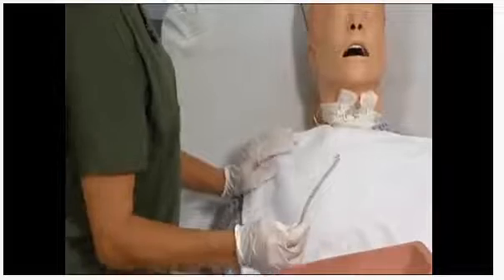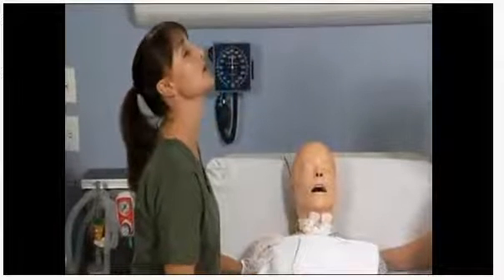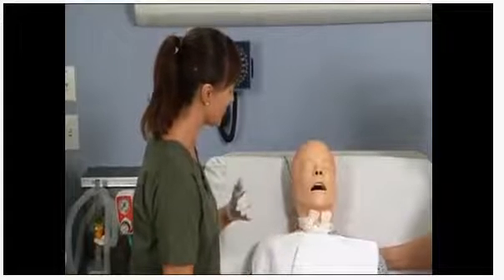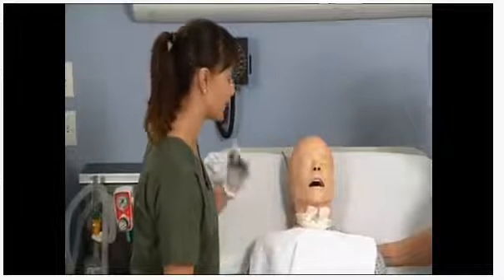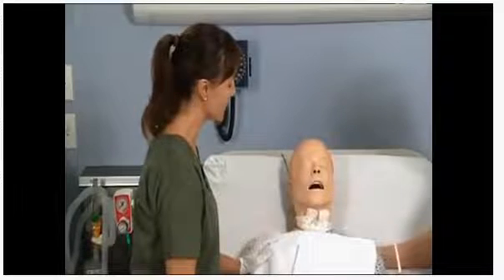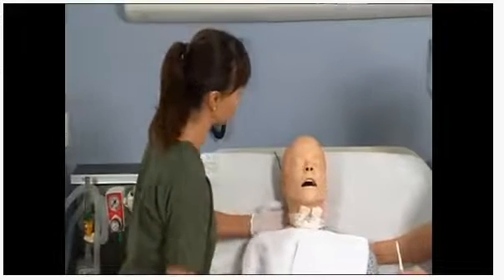Okay, Mrs. Jones, let me explain everything that I'm going to do, okay? As I begin to insert this NG tube through your nose, I need you to tilt your head back as far as you can. This will help it get through the nasal cavity. When you begin to feel it in the back of your throat, will you just let me know so I can stop for just a minute and then take a look inside your mouth. As we begin to advance, I'm going to have you begin to swallow, put your chin to your chest and swallow, and take a couple of sips of water that Deborah's going to give you. Is that okay with you? Okay, are you ready to begin? All right, Mrs. Jones, here we go.